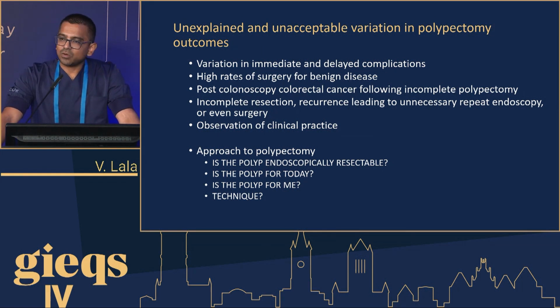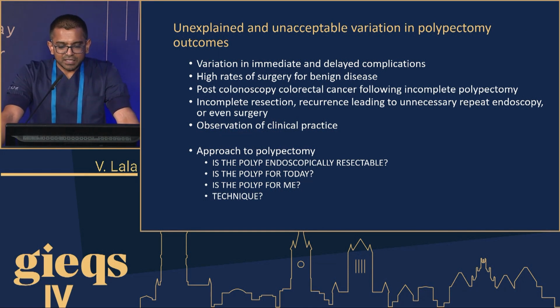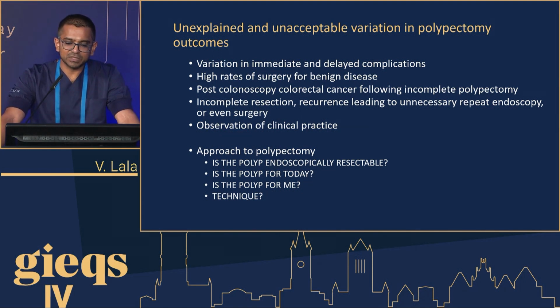So the first step that I usually take when looking at a polyp, and when deciding if the polyp is within your reach or within your domain in terms of resection, is just to ask a few simple questions. Firstly, is the polyp actually endoscopically resectable? And if it's not, if it's clearly invasive, then that's a candidate for surgery. The second question to ask is, is the polyp for today? If the answer is yes, the next question to ask is, is the polyp for me? So do I have the expertise to deal with this polyp? And then finally get into technique.